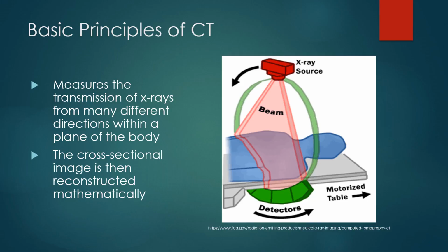The X-ray beam rotates around the patient within the scanner gantry such that multiple X-ray projections pass through the patient. The X-rays produced, while paired with an electronic detector array, document the pattern of densities in the patient. Using this data, the CT will create an axial cross-sectional image from the mathematical reconstruction to be viewed by the technologist and radiologist.